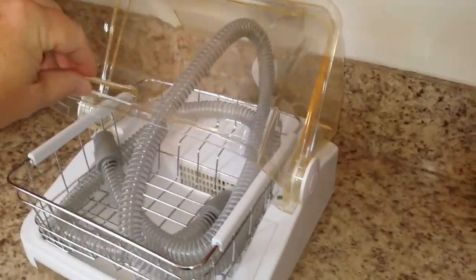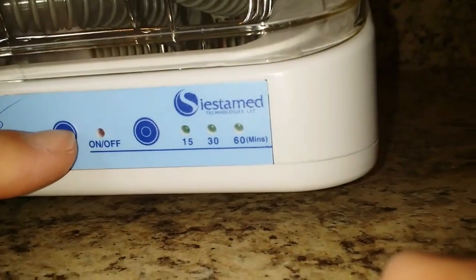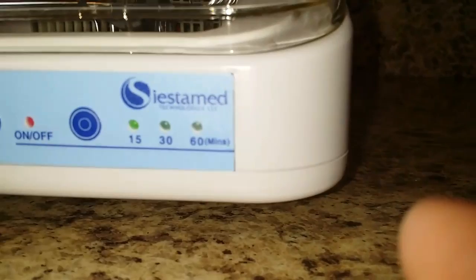Pretty simple. It just kind of closes down there, and then it's got this button here to turn it on. The default is 15 minutes, and you can adjust that just by pushing this button right here.